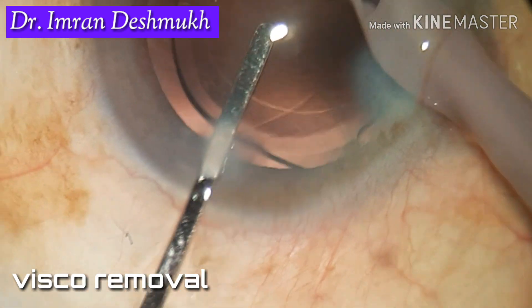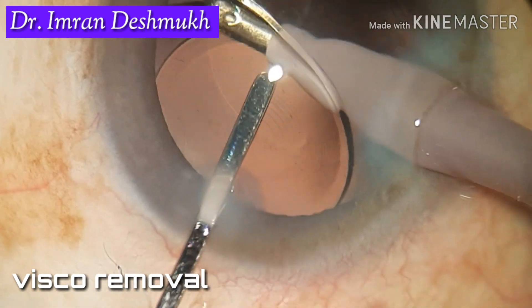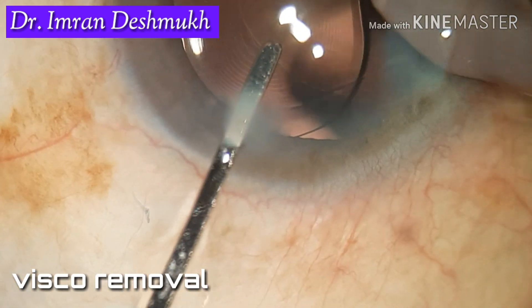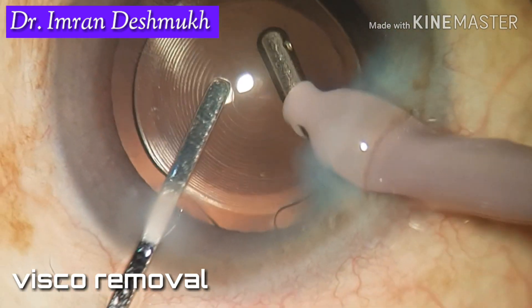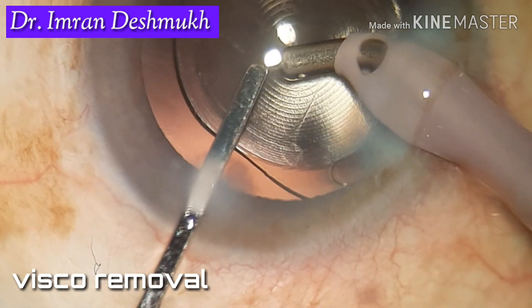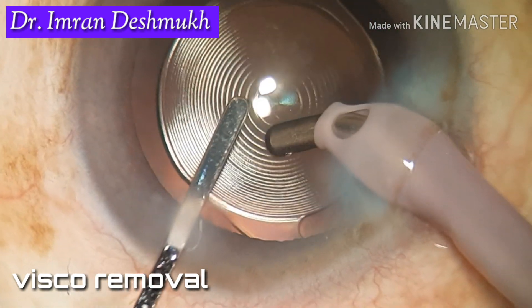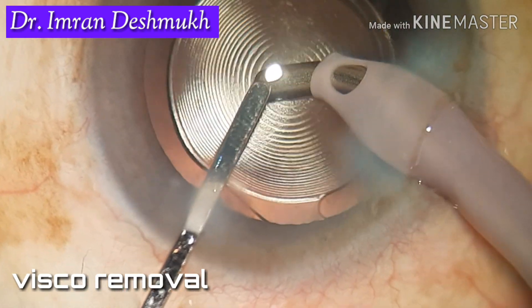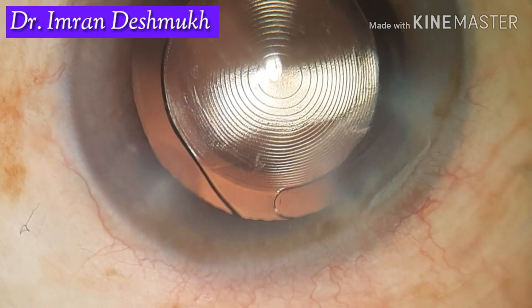What I usually do in all of my cases is go behind the lens and remove as much visco as possible, whether it's a hydrophilic or hydrophobic lens. Make sure not even a little visco is left at the end of surgery, as that can cause a significant rise in IOP post-operatively. Be slow, be steady, and once you see no visco is left, you can remove the IA probe.